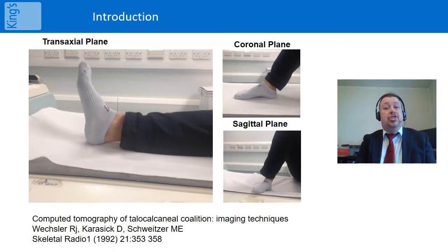Back in 1992, in the days of axial CT scanning, various positions were recommended for imaging of the feet. Nowadays, CT scanning is still undertaken with the foot placed upright in the field of view, such that the plantar surface is parallel to the scanner's transaxial plane. Holding such a position for the 20 minutes required for a SPECT CT study may, however, be quite difficult.